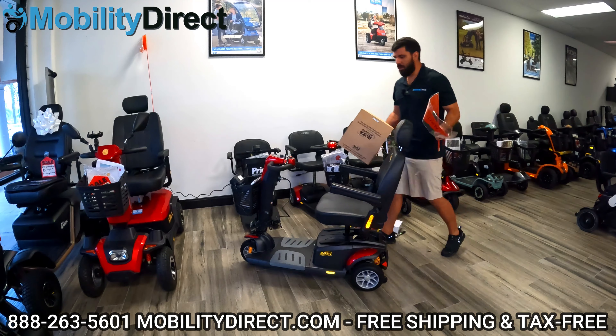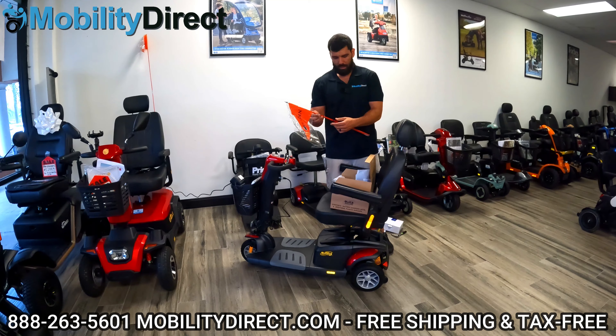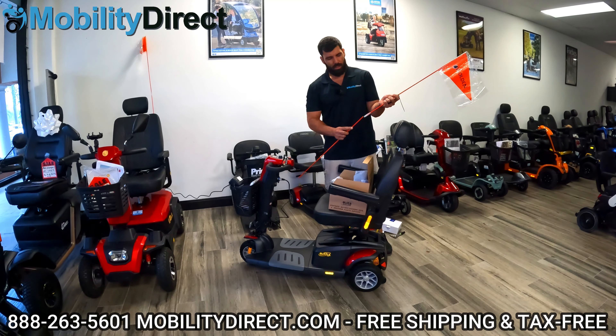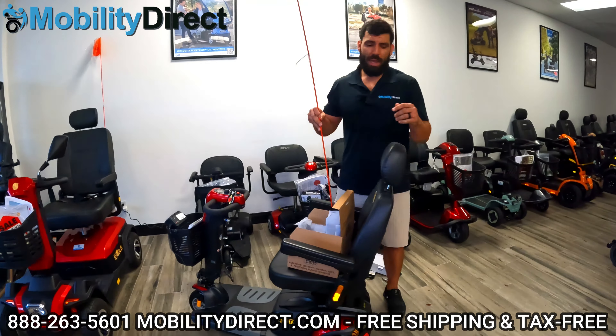We've got a few other things to go over. We've got our safety flag here — a lot of people love them. There's a little breaking point halfway up the flag. On the back there's a pouch with a little stitch that allows a perfect fit for the flag to go down in there. Now you've got your safety flag installed.